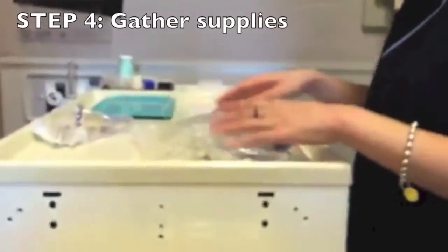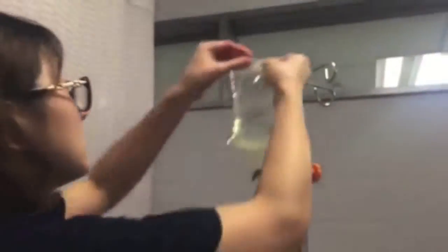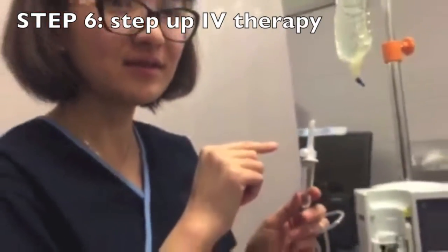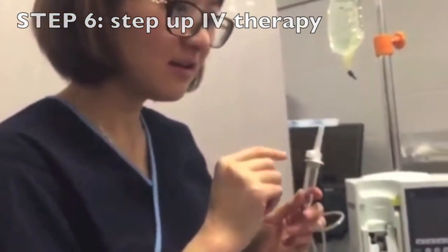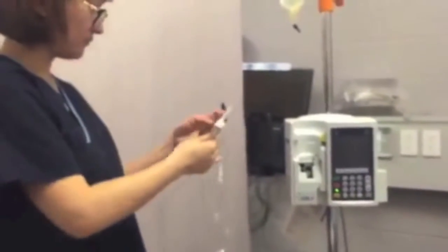Gather supplies. Check the IV solution using the eight rights of drug administration. Check the solution for color, clarity, and expiration date. After opening the sterile package using sterile aseptic technique, maintain sterility of both ends. Place the roller clamp about 2 to 5 cm below the drip chamber and close the roller clamp.